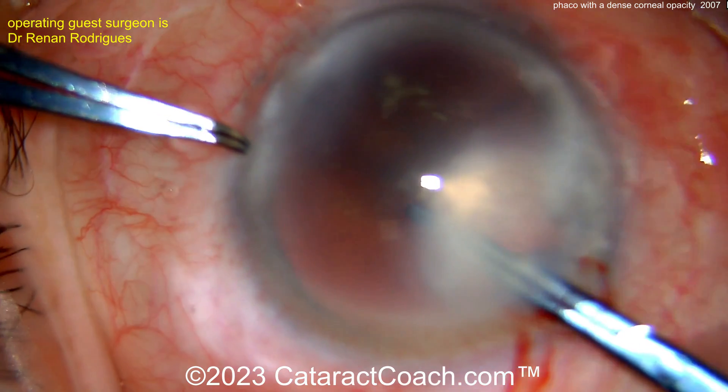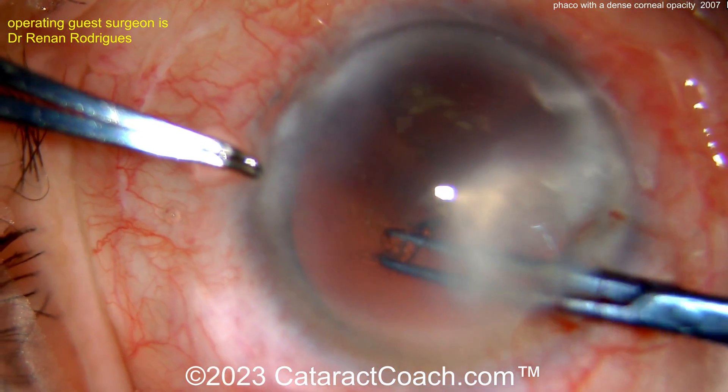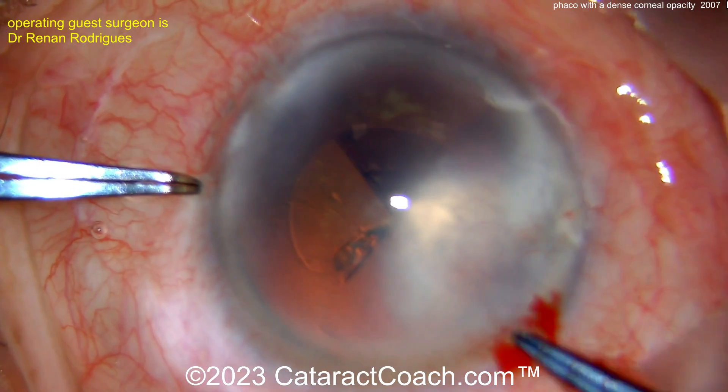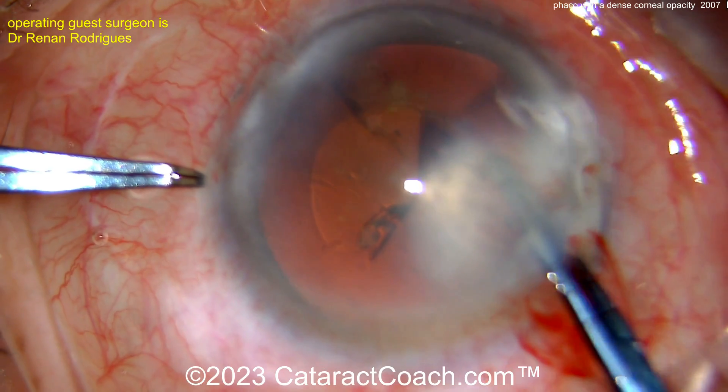A good way of determining that is to ask the patient, what was your vision like 10 years ago? So if the scar's been there for 30 years, how was your vision 10 years ago? Because you probably didn't have much cataract then. If the vision was good enough and you were happy enough, then the better part of judgment is to just do the cataract surgery like we're doing here.